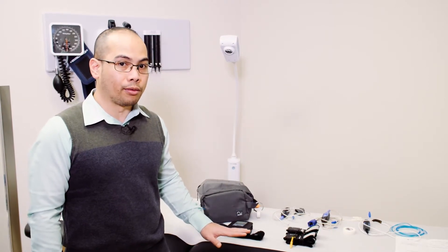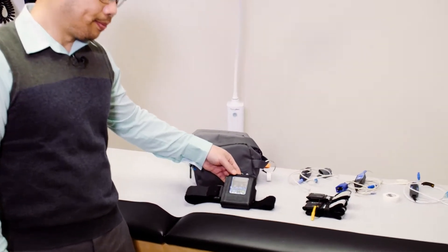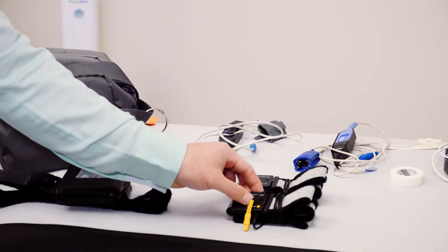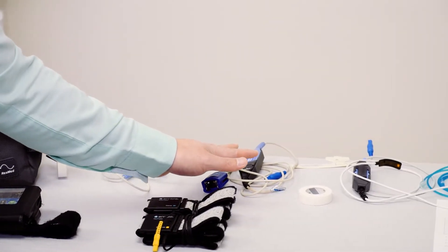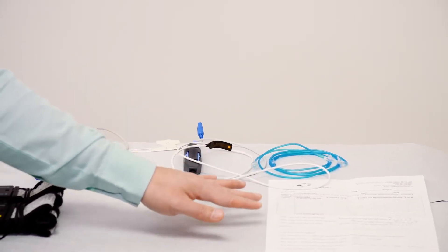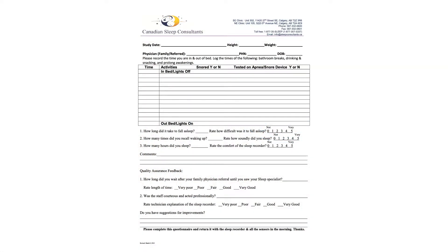For this particular sleep study, these are the sensors and recorders that are involved. You will see the main recorder. You will also have belts on your chest and belly. You will have finger sensors, which come in three different types. And lastly, the nasal cannula, which will be placed on your nostrils. You will also be provided with a sleep log to record the night of the sleep study.